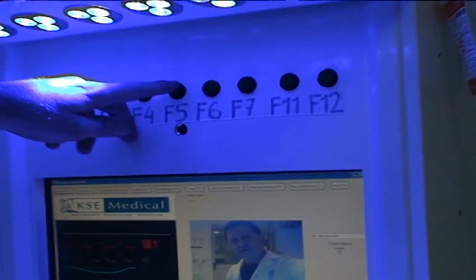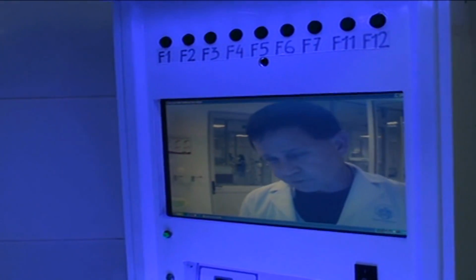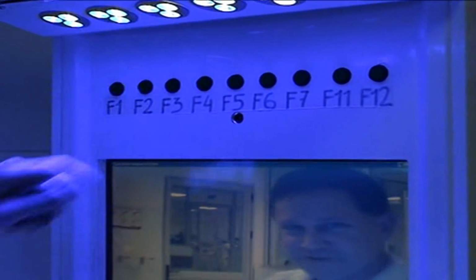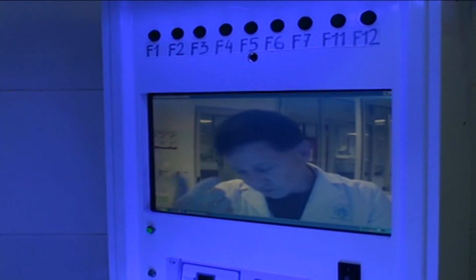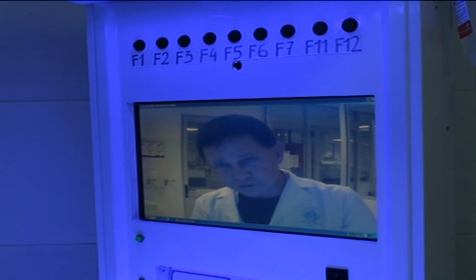Then we also have features, for example, like this is the webcam. We have two webcams. One webcam we call the doctor webcam. That's me right there. This is designed so that a doctor will be looking at the doctor from a remote hospital. This doctor could be in America, could be at Harvard Medical University Center and teaching doctors here how to do a new procedure. He can see the doctor here. This doctor will see that doctor and watch what they're doing.